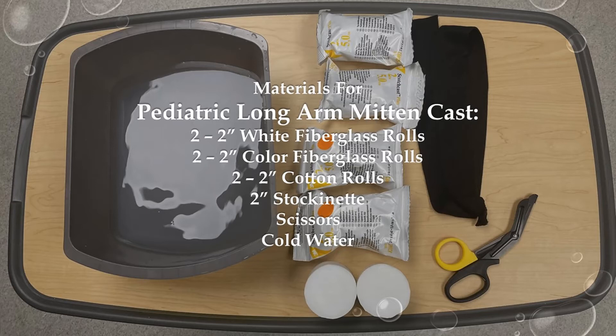To prepare for the long arm mitten cast, size the two-inch stockinette from the fingertips to the proximal humerus and leave about 3 inches of extra stockinette on each end. Do not open the fiberglass until you are ready to apply it, because it will harden when exposed to air. Lastly, make sure you have cold water.